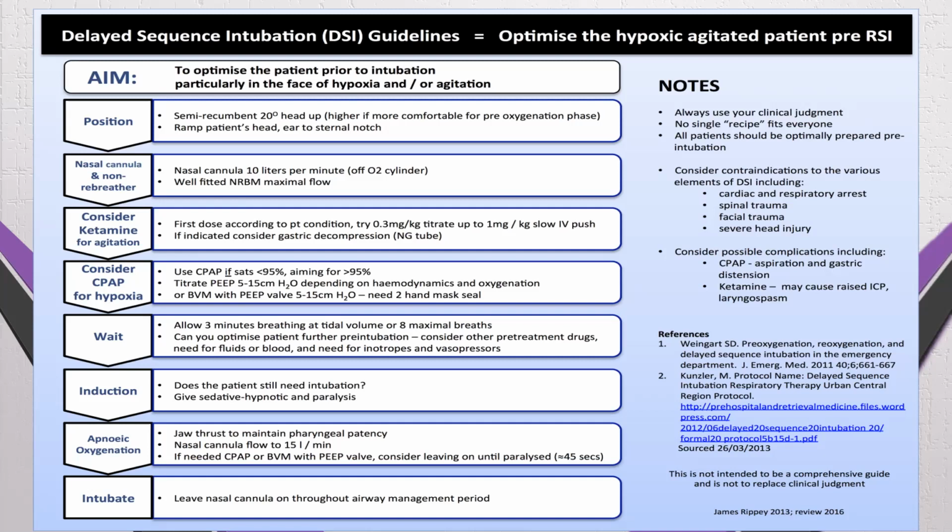Consider leaving it on until paralysis, at least 45 seconds for the patient to get paralyzed. Then intubate your patient, and as I recommended, leave the nasal cannula on through the airway management period and even through extubation and post procedure.